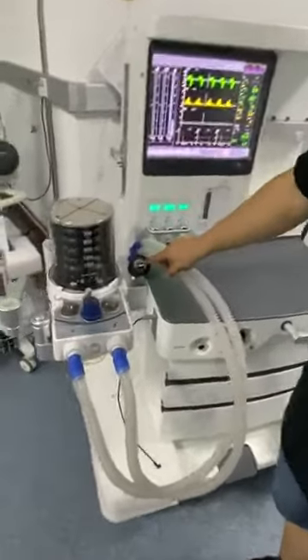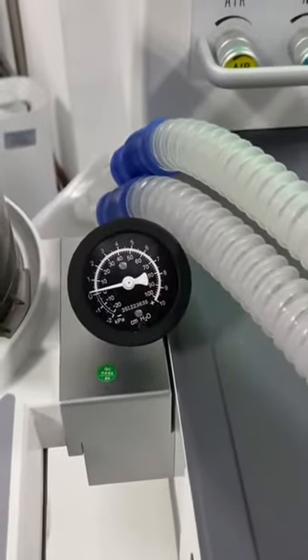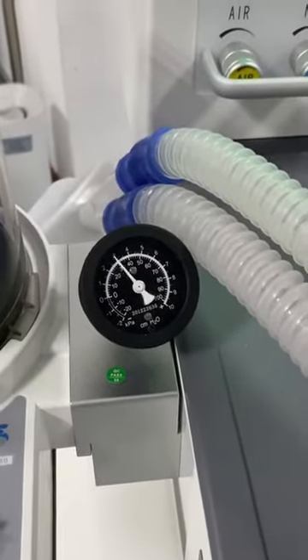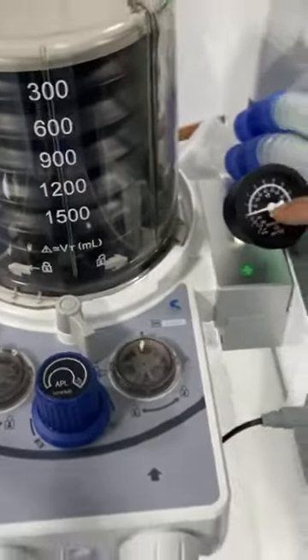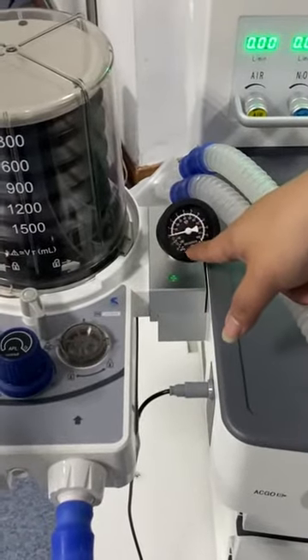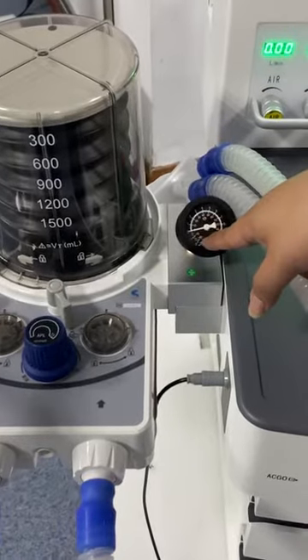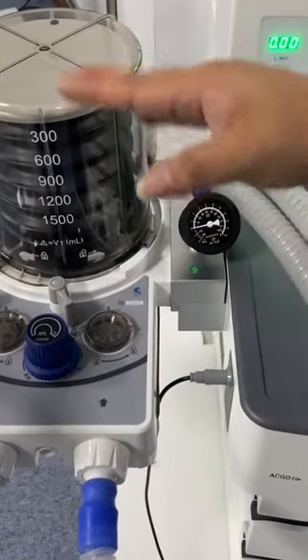This is the total pressure gauge. This gauge is also very important. For example, sometimes if we think the machine has any leakage inside, then we can switch to manual ventilation, and then we check this gauge. If the line never gets to zero, then it means there is no leakage. If the line is getting to zero slowly and slowly, it means there is leakage inside.